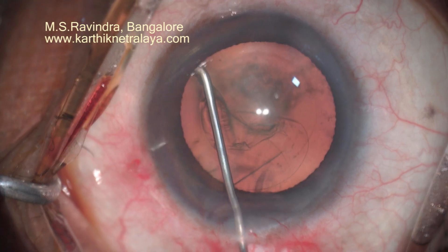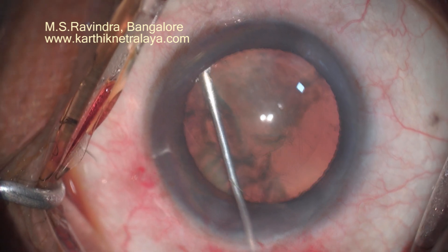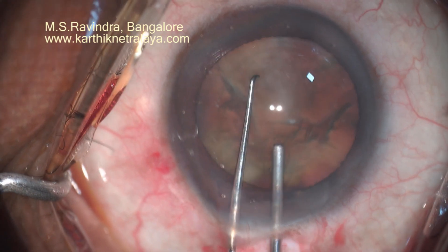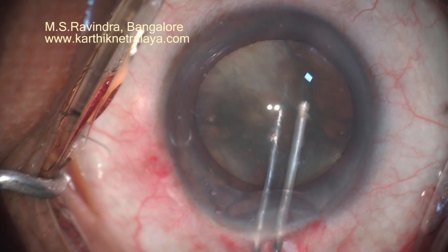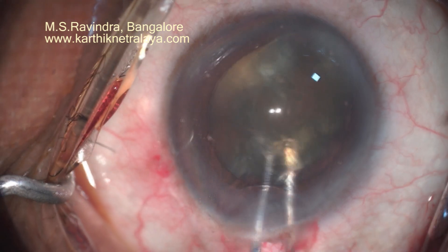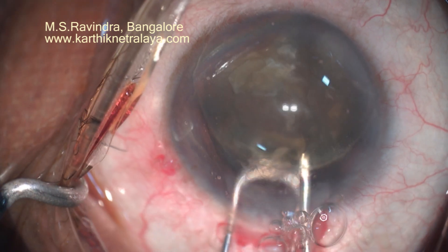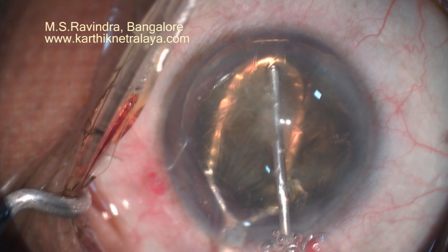The tunnel that you have made is enlarged with a blunt keratome. A capsular-separating hydrodissection is done with a special cannula which is bent to 45 degrees at about 2 mm from the tip. A few drops of balanced salt solution are required to do a good hydrodissection separating the capsule, the nucleus, and the cortex.